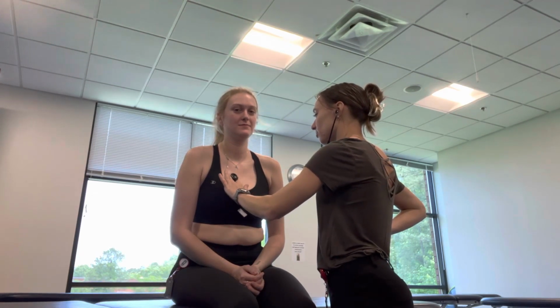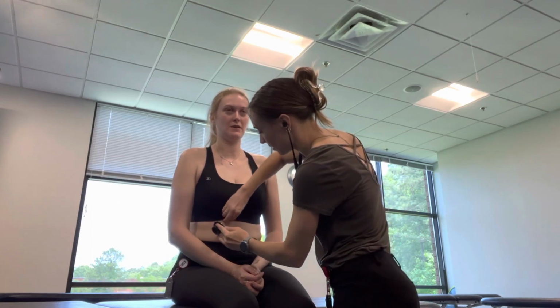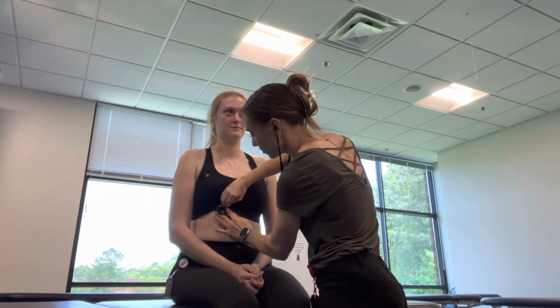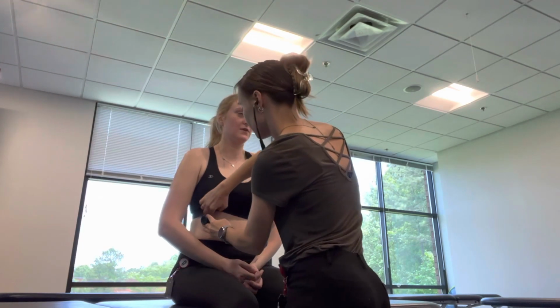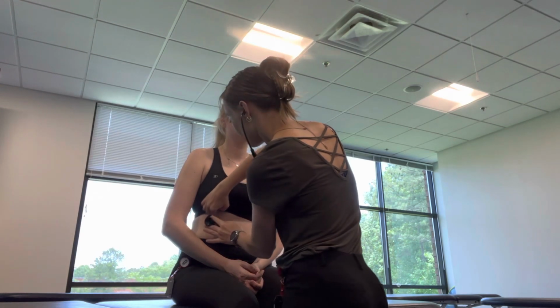Beautiful. And we're going to go pulmonary. Beautiful. I'm going to pull this up a little bit right here. We're going to do tricuspid. Beautiful. Sorry, my hands are cold. You're fine. We're going to come right over here. Beautiful. Okay. You're alive.